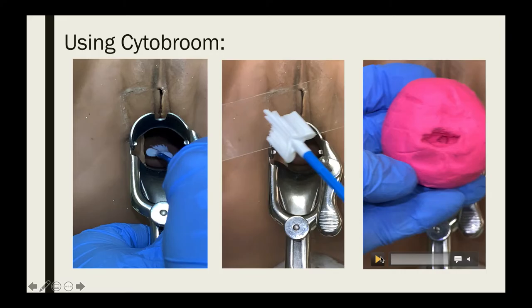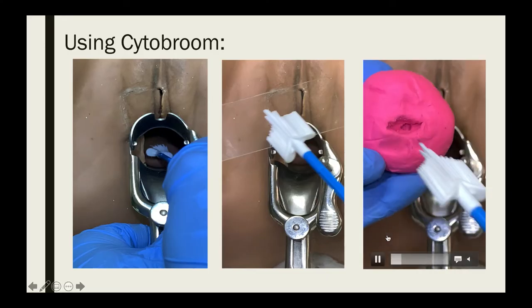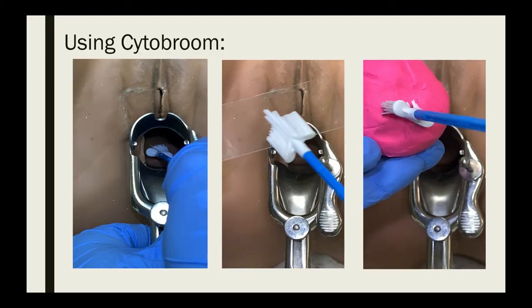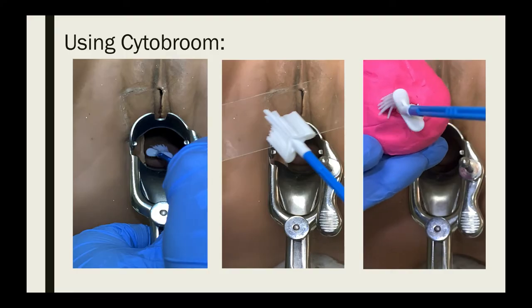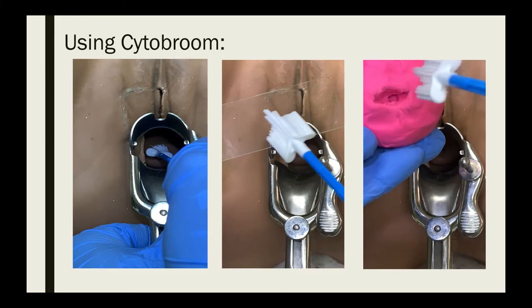To give a clear view of the cytobroom technique, here it is demonstrated using a clay sample. Insert the central bristles into the endocervical canal deep enough to allow the shorter bristles to fully contact the ectocervix, then rotate the broom clockwise for five complete 360-degree turns.